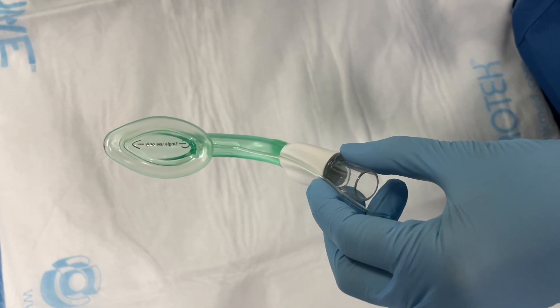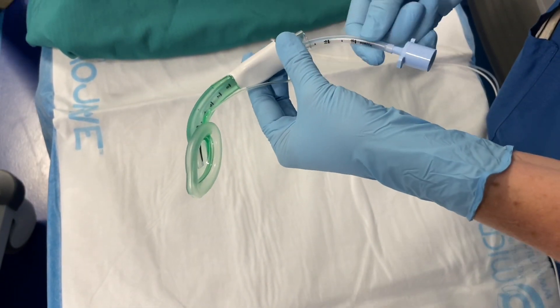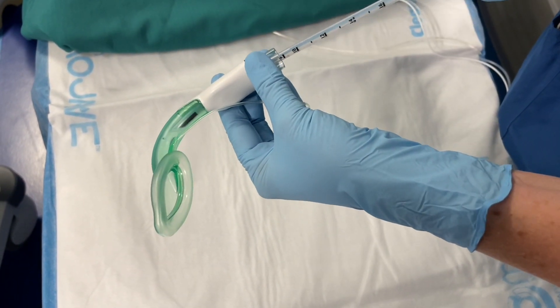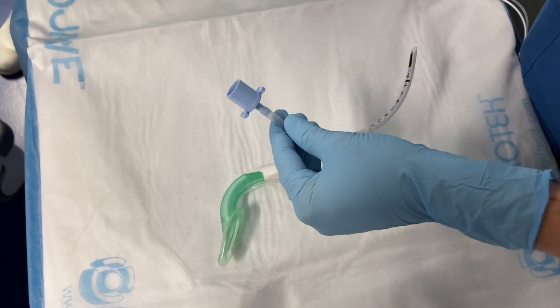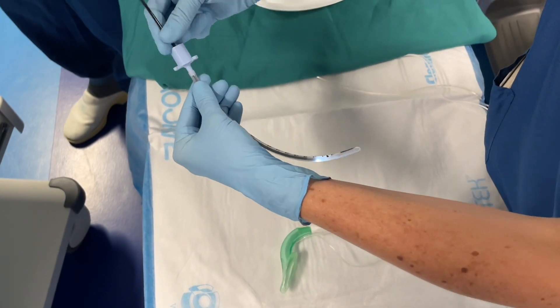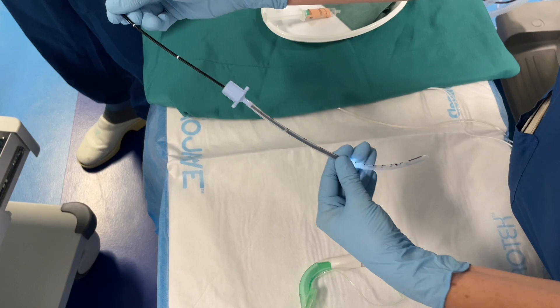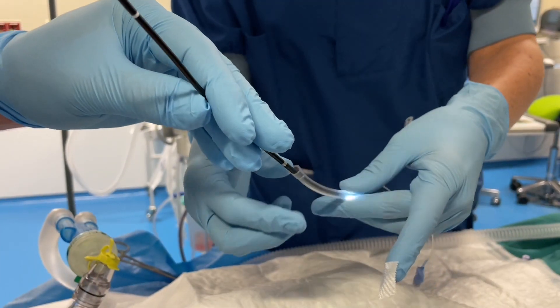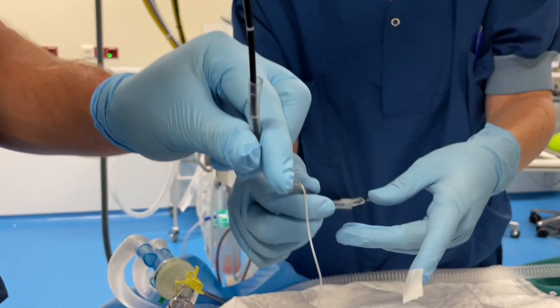Thorough preparation is essential before performing a flexible intubation through the laryngeal mask. After selecting an age-appropriate tube, make sure that the tube fits through the laryngeal mask and that the flexible scope fits through the endotracheal tube. Apply sufficient lubricant. After removing the 15mm adapter, put the flexible scope through the tube and fix the tube using a plaster.